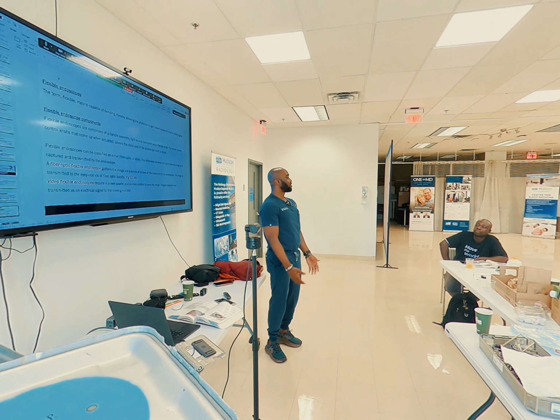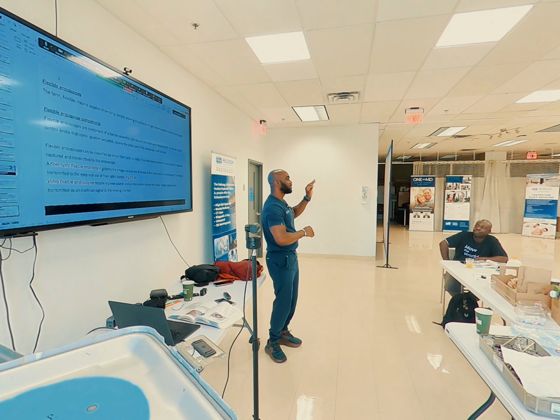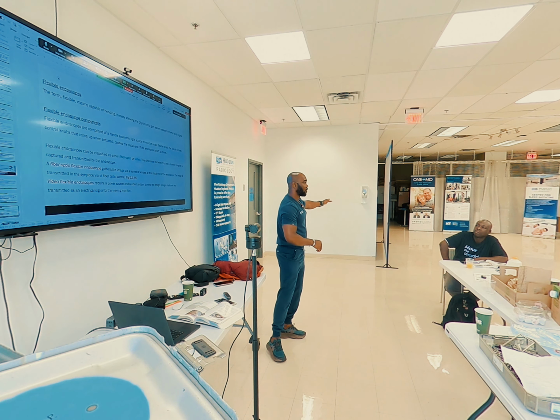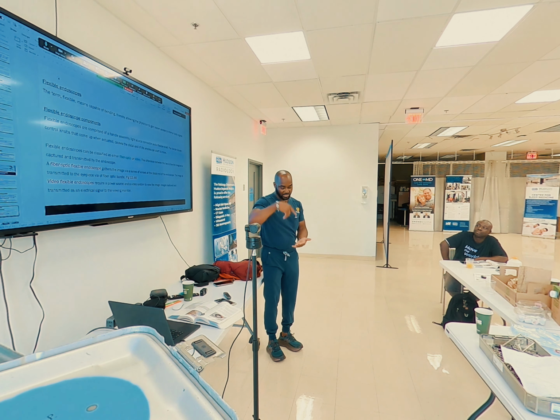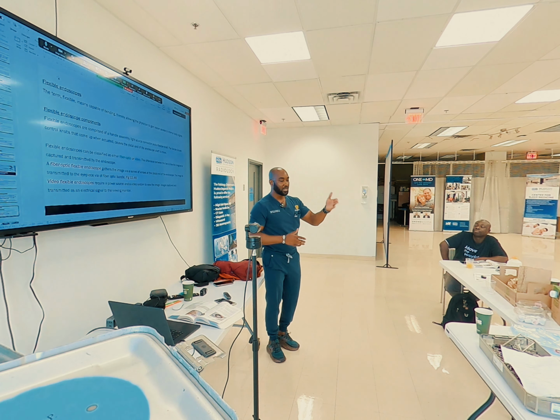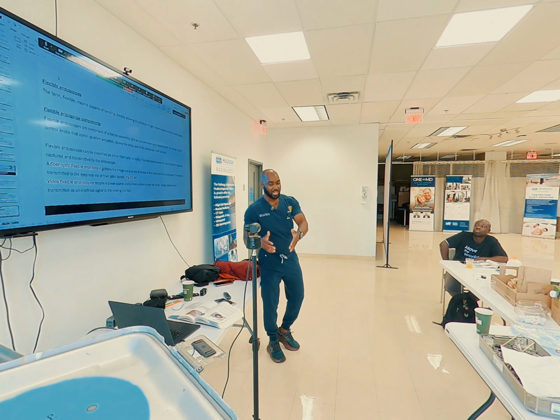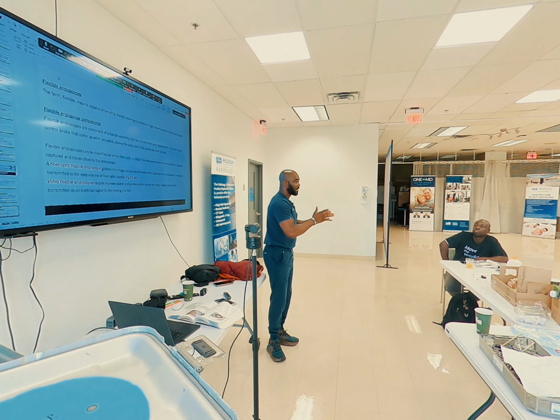Okay, if you lie and said you got everything right, they want to know when you ordered that disinfectant. The catalog number will be with material management. They'll go back to material management and check that order. Also remember, your disinfectant has an expiration date from the date it was opened, based on the use life, and your use life might be between 14 and 28 days. When these guys investigate, they are professionals. They know what to look for. So if you lie on the documentation and there's a hepatitis C outbreak from your hospital resulting from a high level disinfection or from a flexible scope, you'll go back in time, step by step by step.